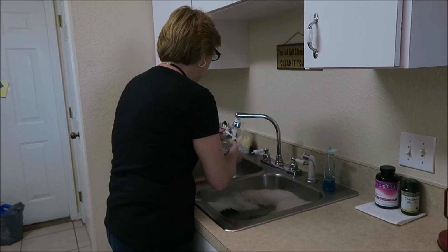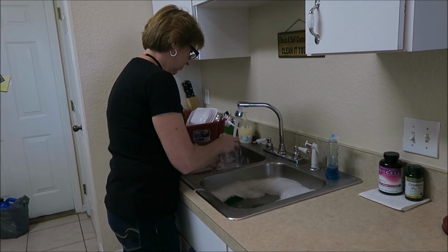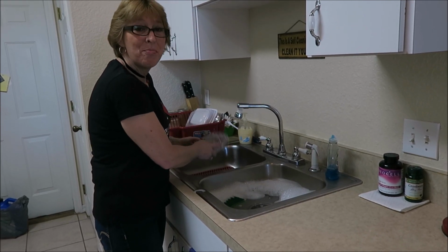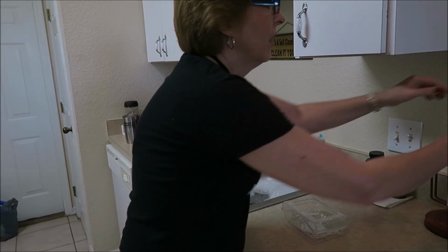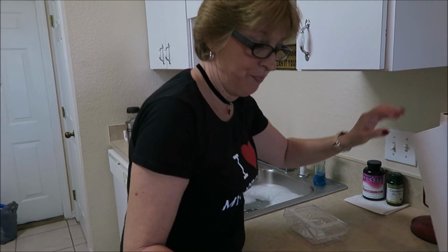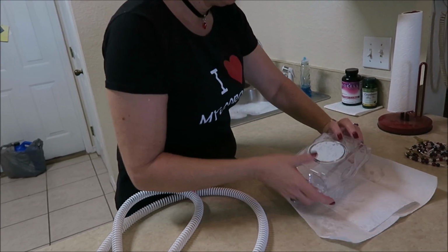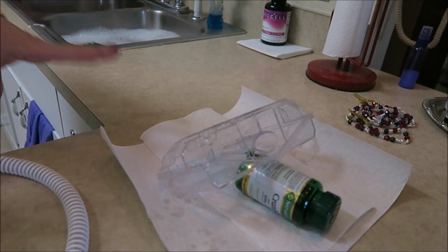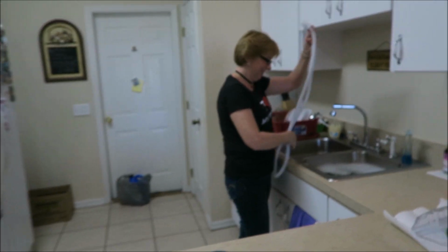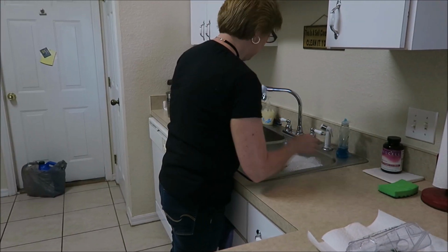Again, rinse it in some really, really hot water. BB's a big fan of hot water. The hotter the better. This is what I do. They want you to let it air dry, so I do this and do this. Then I take my little bottle of the cranberry pills and let it just sit there and air dry. This is the fun part. Let's get my sponge up out of the way.